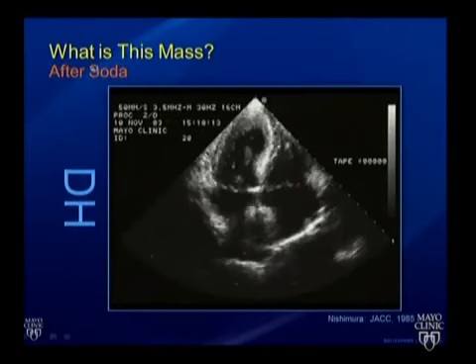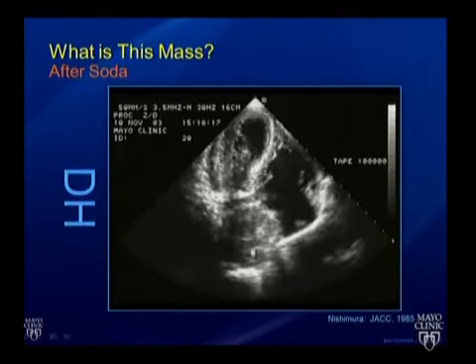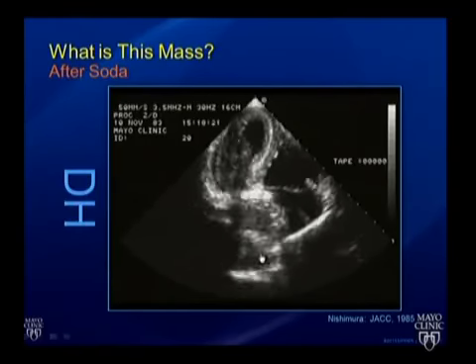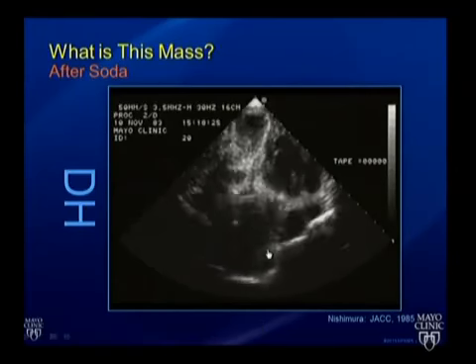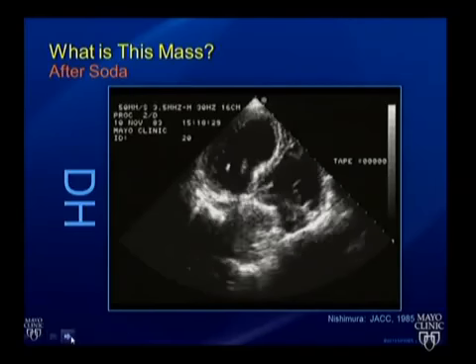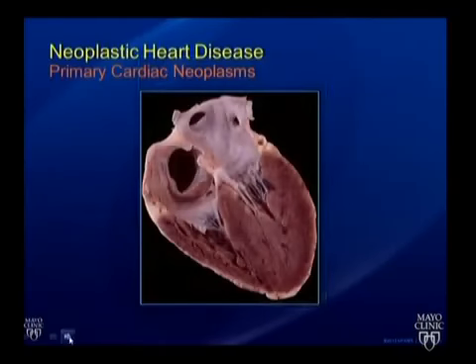You tell the medical student to run down the hall, buy a Vernors if you're in Michigan, or Coke if you're here, and drink. And you wonder why you have reflux afterwards. But that's it. Those are bubbles. That's contrast coming from the pop that he just drank. You're tilting back and forth in the plane and catching the diaphragmatic hernia that's pushing up. And just being out of plane a little bit, you're catching that pseudomass. And you can see on the chest x-ray how prominent it was.